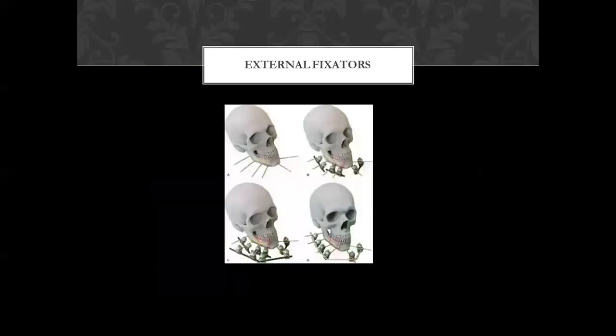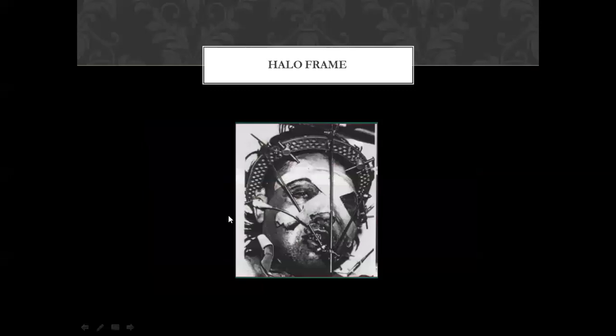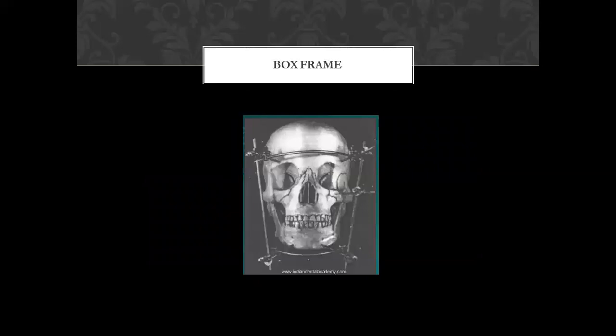Coming to the external fixators. Until now we have seen internal fixators; now we'll see the external fixators. These are the external fixators, such as the K-pin, which is most commonly used for condylar fixation or mid-face fixations. You can see this halo frame, which is most commonly used for mid-face fracture fixation. Remember, the halo frame is an external fixator used for mid-face fixations. Box frames, you can see, are used for patients presenting with Le Fort II fractures.